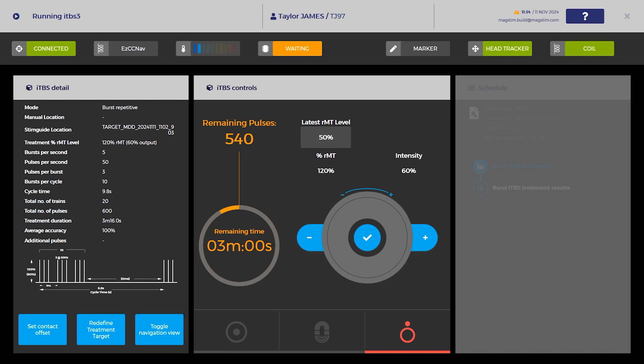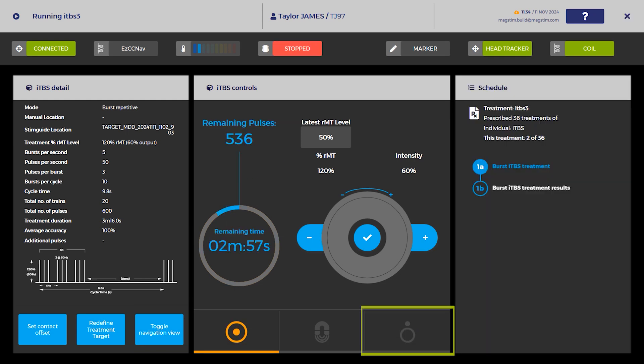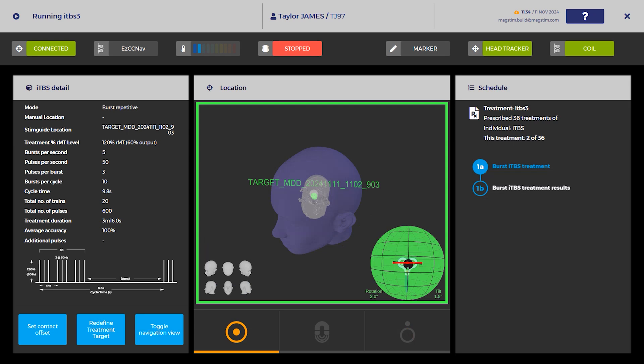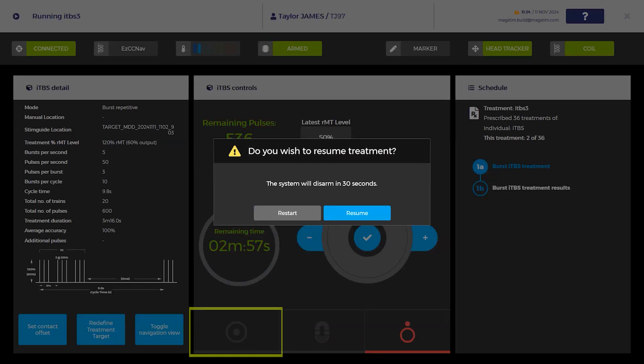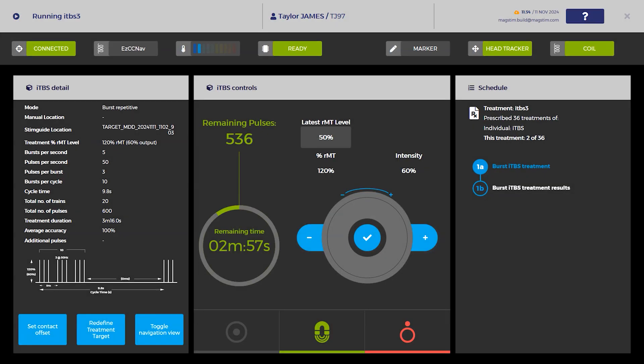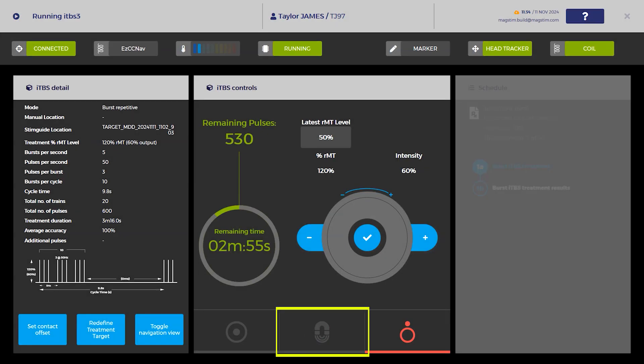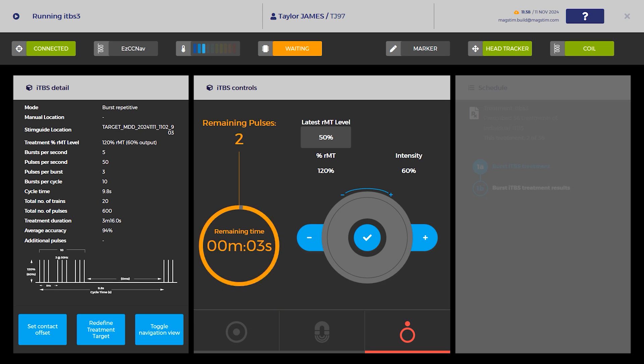If treatment needs to be paused, press the red stop button. To resume the treatment, recheck the coil position and press the amber arm button to charge the system. Confirm the session is to be resumed. Press the green trigger button to resume the treatment session.